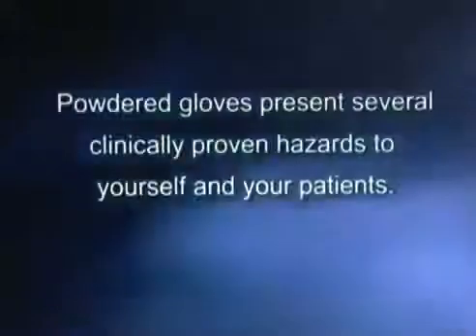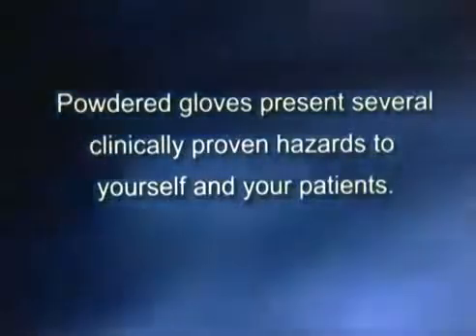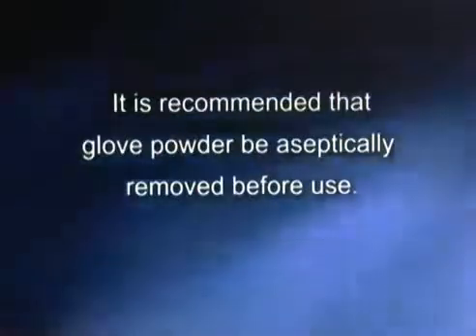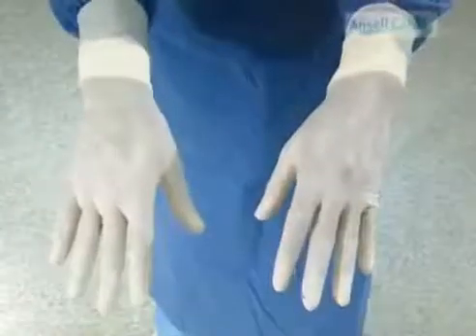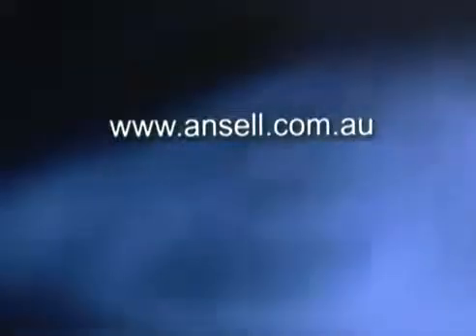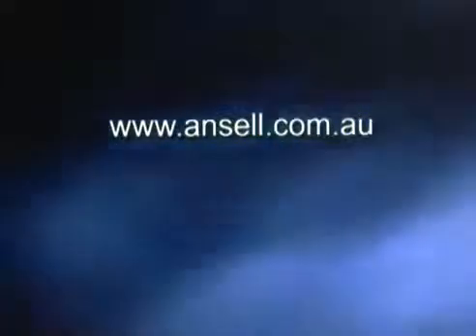Please note that powdered gloves present several clinically proven hazards to yourself and your patients. It is recommended that glove powder be aseptically removed before use. It is seen as much more cost-effective to move to a powder-free surgical glove. Please see the website for details of hazards of glove powder. Your hospital will have a preference, either generally or departmentally, as will you with experience.